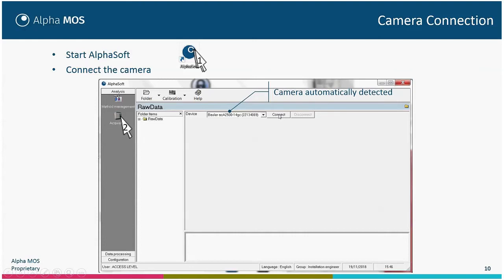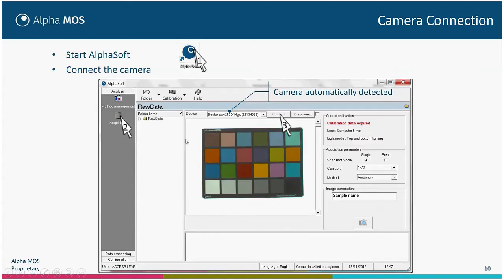You click on Connect, which will show an image of the interior of the cabin. We advise to put the color checker in order to see an object; otherwise the image will appear white — a white rectangle indicating light only with no sample. Here you can see that the current calibration is expired, meaning that when you start, one of the first steps is to calibrate the camera.